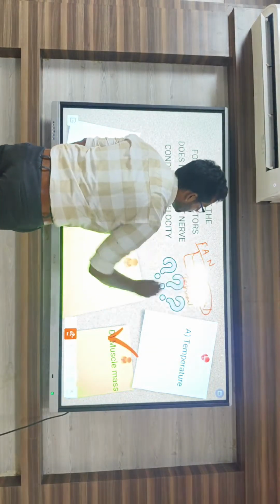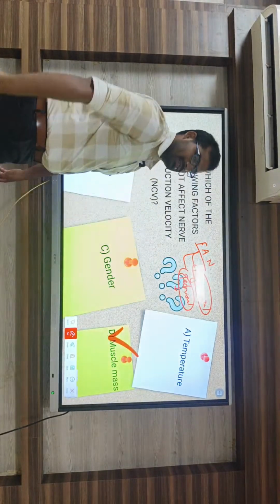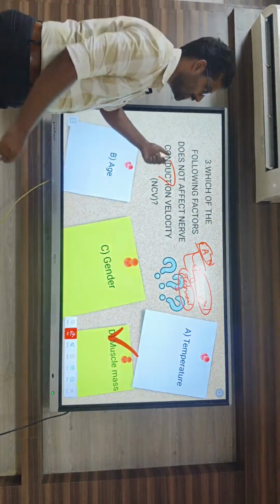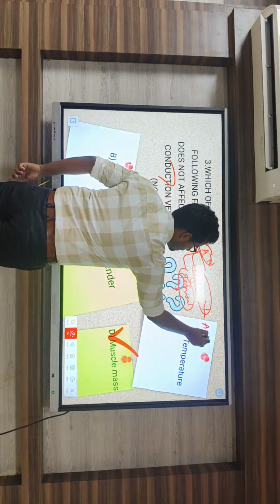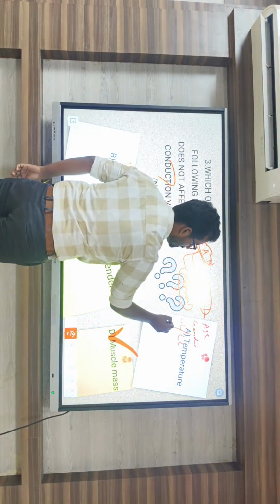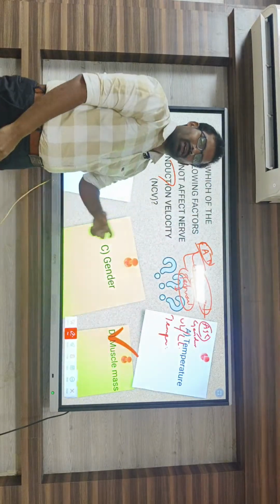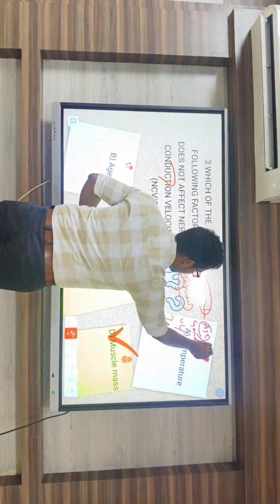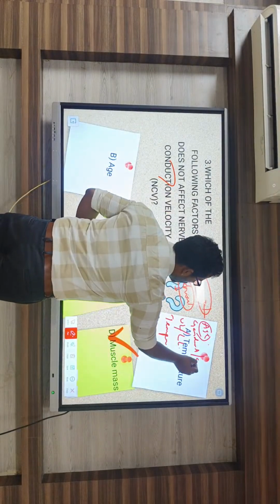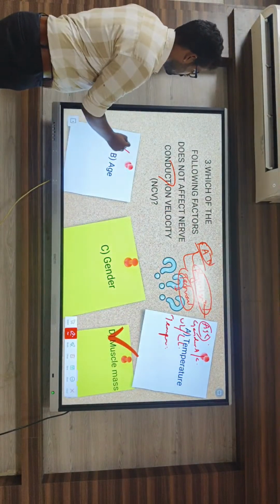So physiological factor அப்படினு பார்த்தோம்னா that is the patient circuit, and technical factor அப்படினு பார்த்தோம்னா that is the machinery circuit. So என்னென்ன factors in the nerve conduction velocity affect பண்ணுது அப்படினு பார்த்தோம்னா இங்க நமக்கு age, gender, upper limb versus lower limb plus temperature. So இந்த இடத்துல நமக்கு age அப்படினு பாக்கும்போது during the childhood level or adulthood levelல nerve conduction ஓட capacity increased இருக்கும். So once நம்ம adulthood cross பண்றோம் அப்படினு பார்த்தோம் அப்படினா nerve conduction velocity reduce ஆயிட்டே போயிட்டு இருக்கும். So age is the wrong answer.